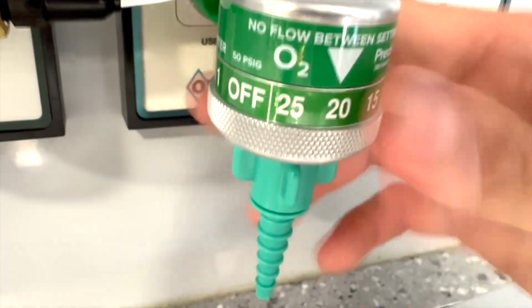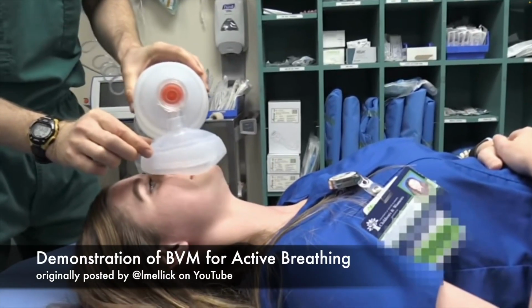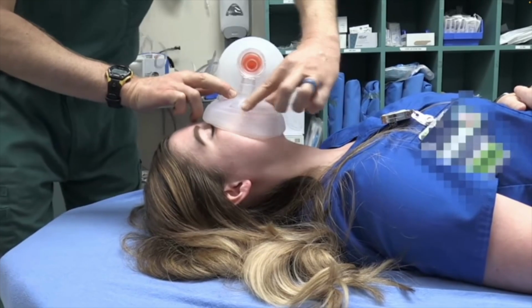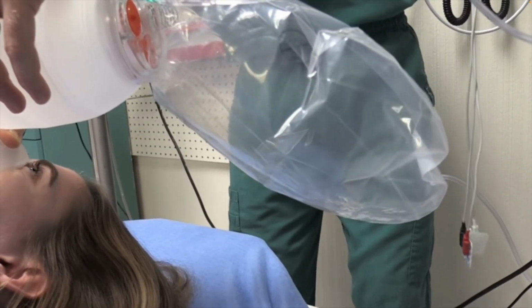Now, as with DSI, if the patient is spontaneously breathing and will tolerate max BVM, well, do that, but do it with a nasal cannula and both of these at flush rates. Just make sure you have a good seal and assure you have a PEEP at 5 or higher to assure that you have good oxygen flow. But you don't need to squeeze the bag to allow them to get oxygen as long as you have that PEEP on. Remember, you're not breathing for them here. You're just making a good seal and providing a higher flow oxygen than you'd be able to deliver with a non-rebreather mask, even a non-rebreather with a cannula.